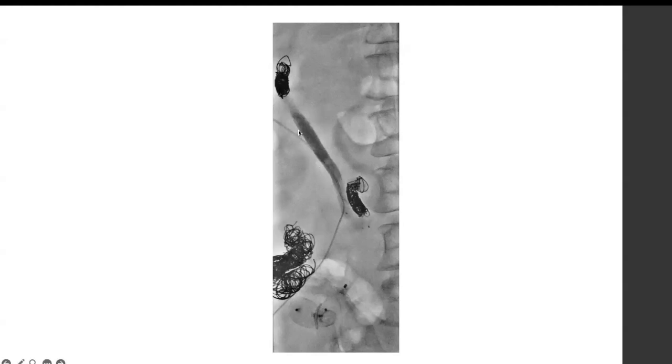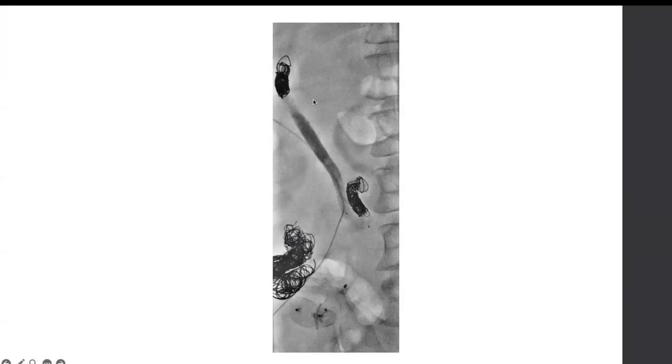So again, our access is in the middle here. So we're closing the inflow and the outflow. And then this is gel foam slurry so we have the coils holding everything in there, and then we inject the gel foam slurry to reduce the risk of any bleeding and make sure everything is completely shut down, and then just pull the catheter out.